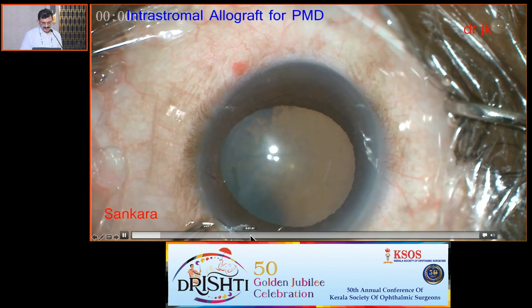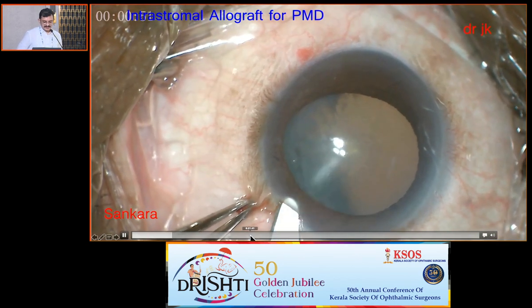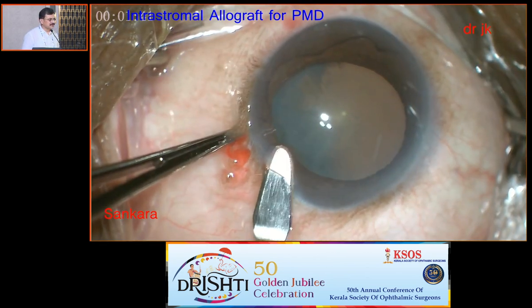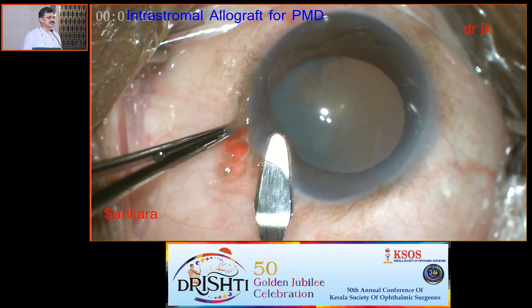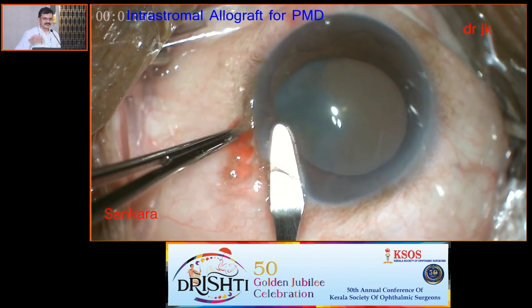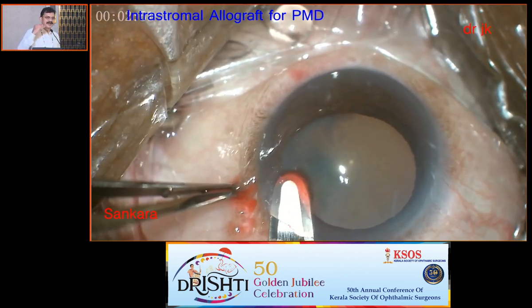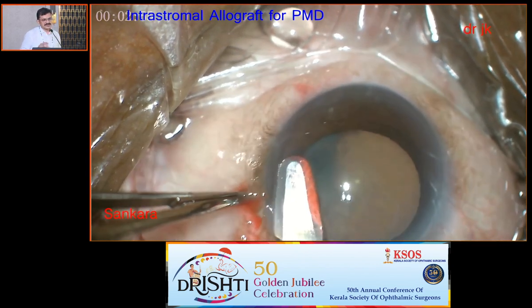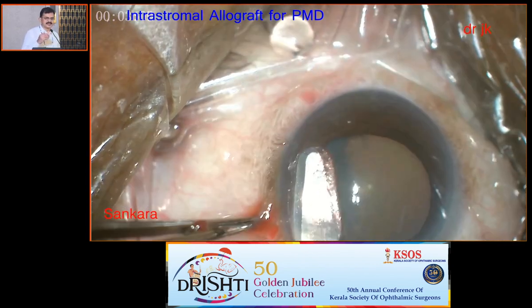We are doing it topically. We just make an incision and, with a manually done crescent blade, make a pocket. It comes. This is a very soft tissue. These ectatic tissues are very soft. You don't need to worry. You don't feel the resistance of normal cornea. In young patients, naturally collagen is not cross-linked. You just pass the crescent, and it gets dissected.